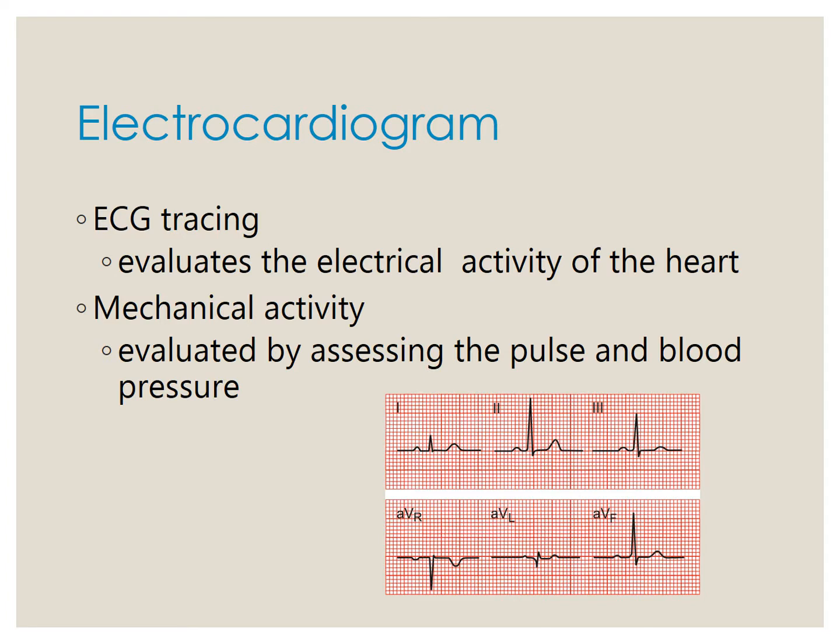Okay, so an electrocardiogram is also referred to as an ECG. You'll hear many people call it an EKG. I honestly don't know where the K came from, but you'll probably hear more EKG than ECG. But anyway you hear about it, it's the same thing. And the ECG tracing is designed to give a graphic display of the electrical activity in the heart.